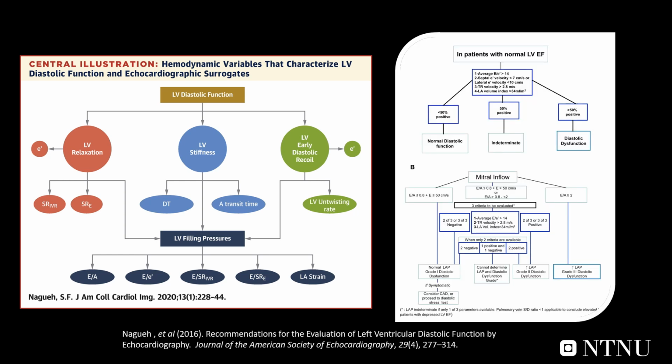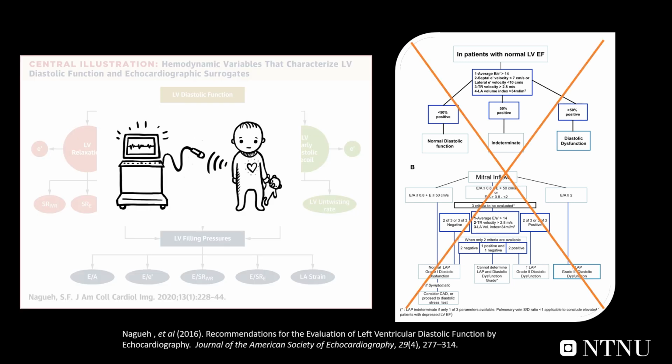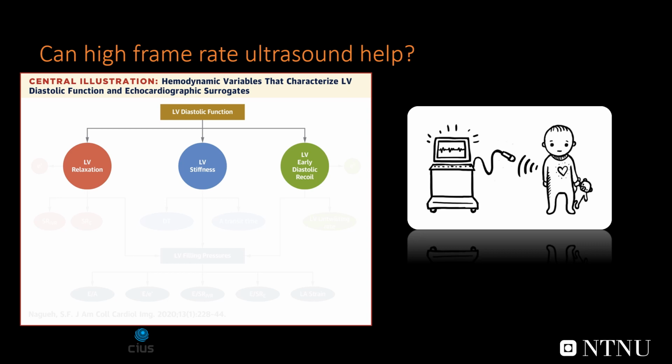But this has been developed for adult cardiology and is not so suitable for children for different reasons like high heart rates, varying pre and after load depending on age, and the large variation in the heart anatomy due to different complex congenital heart defects like single ventricles. So then the question is if high frame rate ultrasound can help in this context.